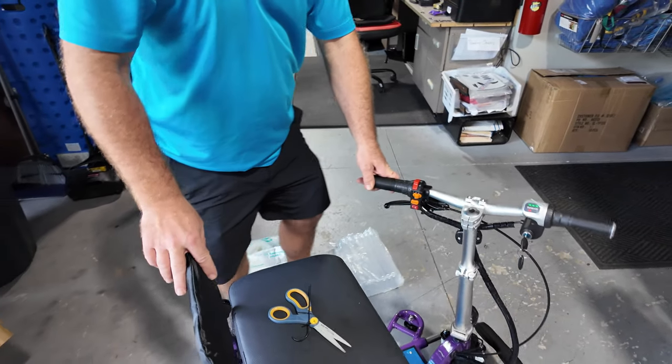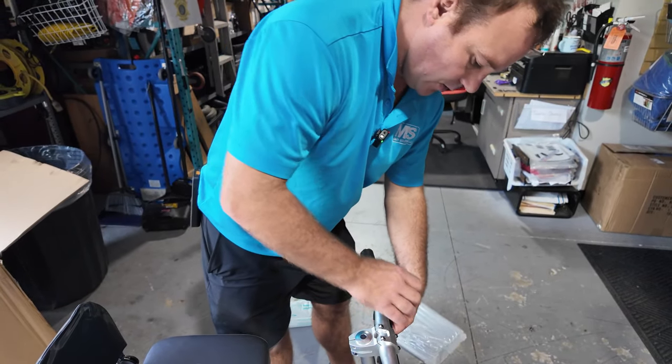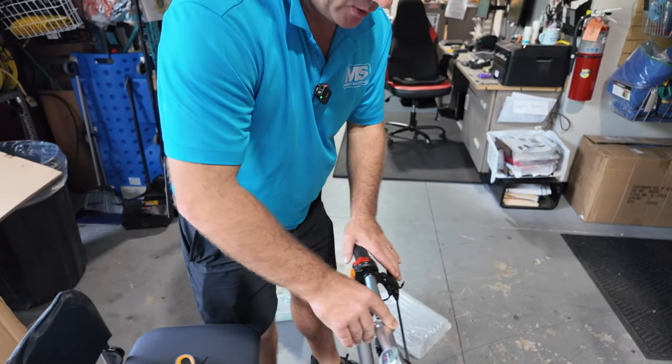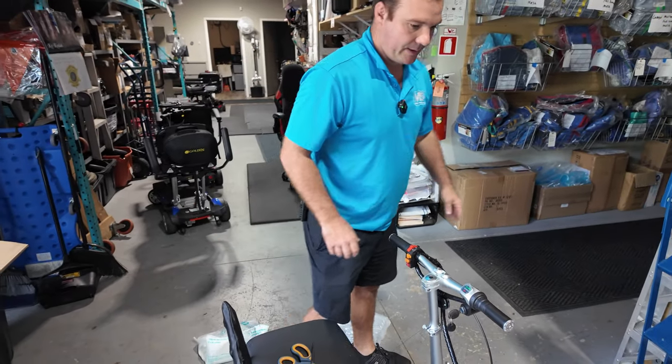Now I'm going to attach the basket. This brake can be moved — if you don't like it right here, you can loosen it and bring it up. You also have locking brakes. Because it's a brushless motor, it's not a locking brake like most scooters. You can pull this to lock it so it stays tight, and pull that to release it.